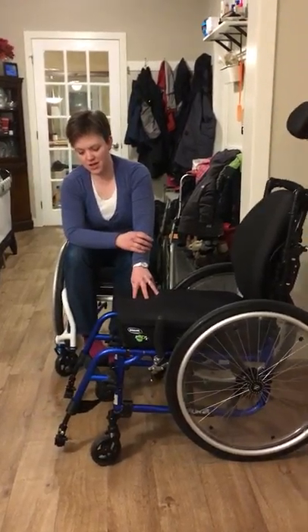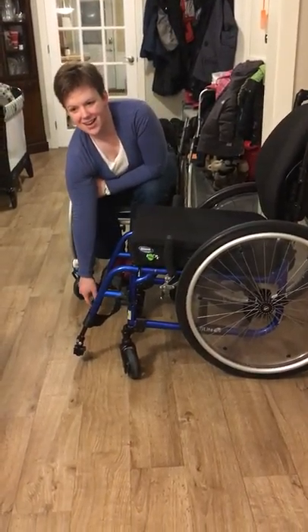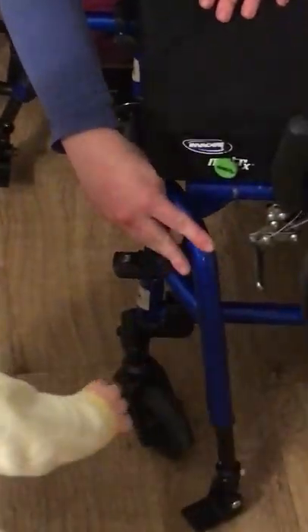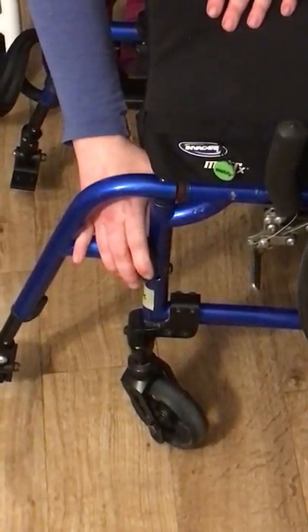So the first thing we're going to look at here is how to move the footrest. Normally you would have foot plates or something down here. You need to take off your calf strap, and then you just depress the button there and it'll swing out of the way, and you can lift it off if you need to. Almost all wheelchairs have this — sometimes it's a button you're pushing and pressing up, but it's almost always going to be there.